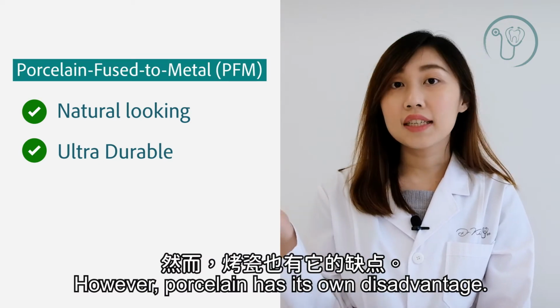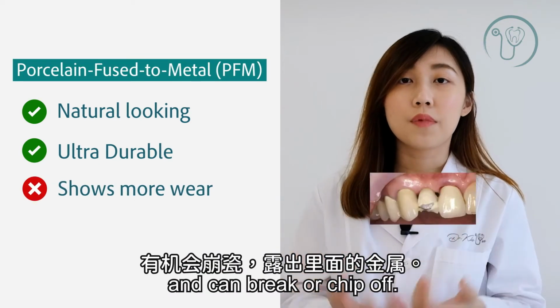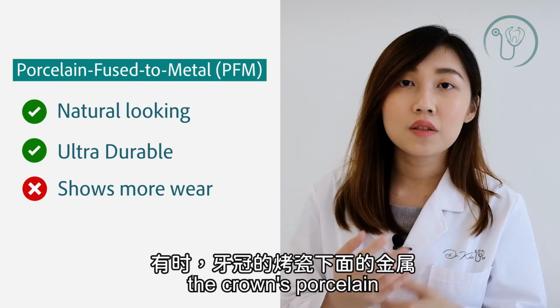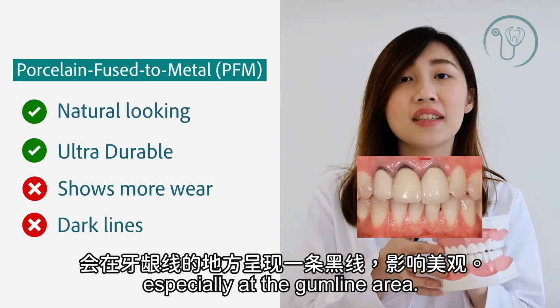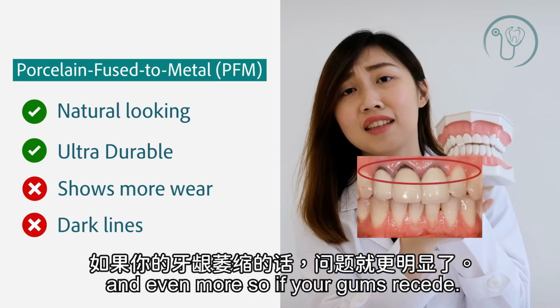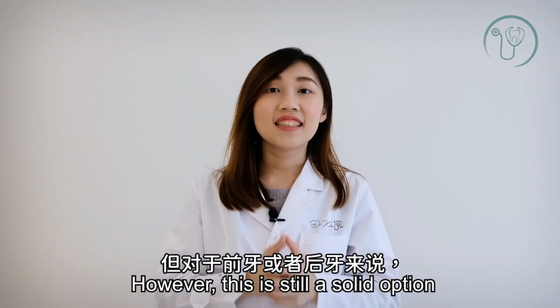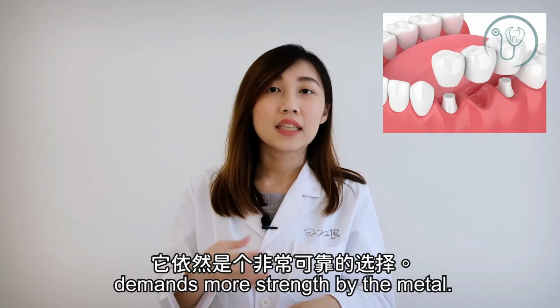However, the porcelain has its own disadvantage because it shows more wear and can break or chip off. Sometimes, the metal underlying the crown's porcelain can be shown through as a dark line, especially at the gum line area, and even more so if your gum recedes.